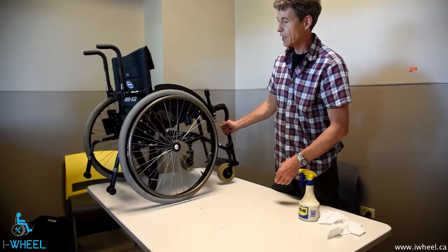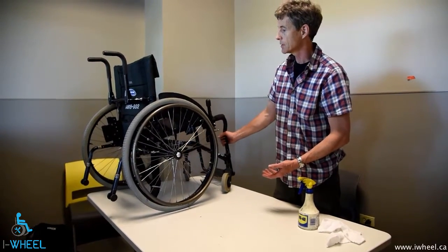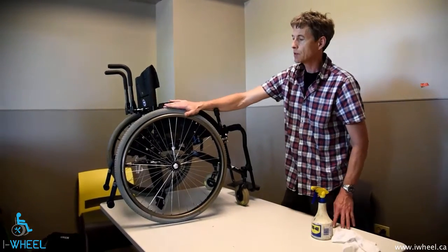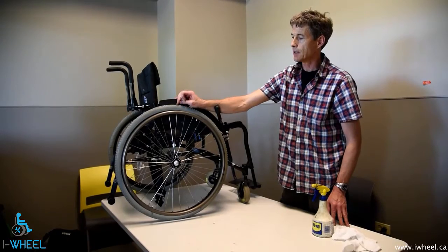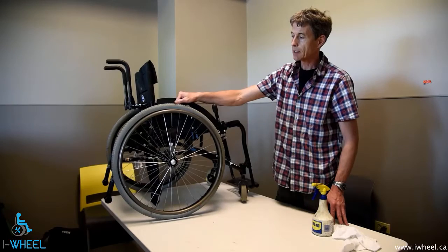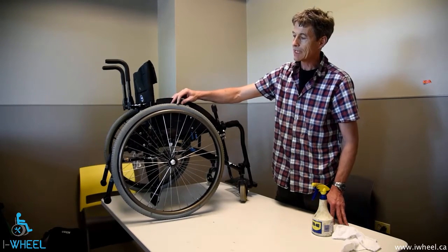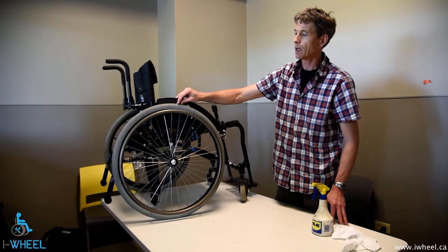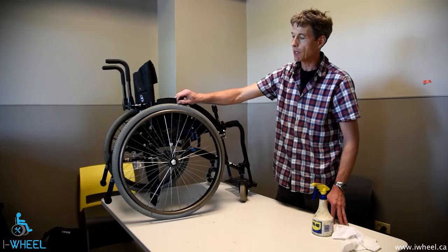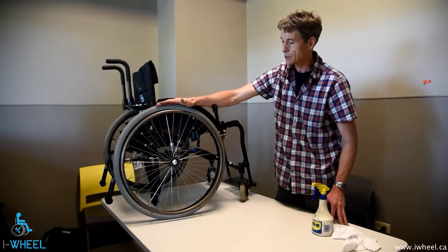Bearings require lubrication but we talked about that in a separate section entirely. That's pretty well it for wheelchair cleaning. It's easy to describe but not very easy to do — it takes a while. You can armor-all your tires. If you use your tires for grip when propelling, cleaning the tires with a mild bleach solution and then washing it off gets rid of any shininess on the tire and restores the grip if you use the push of the tire to achieve traction.